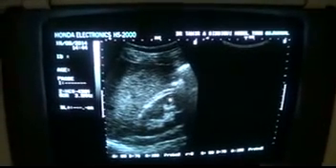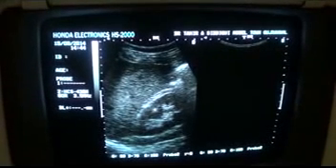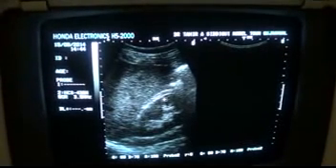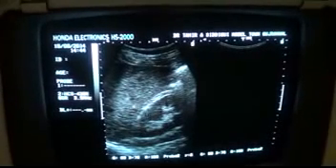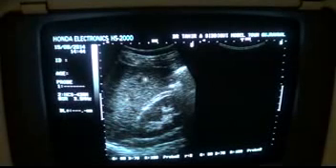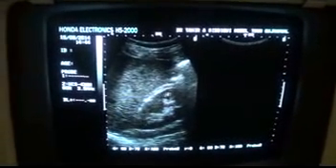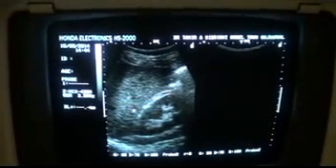Regarding the echogenicity of the renal parenchyma, I have narrated in the previous segment that normally the echogenicity of the renal parenchyma should be either equal to or less than the adjacent liver parenchyma, and you can see that here the renal echogenicity is less as compared to that of the adjacent normal liver.